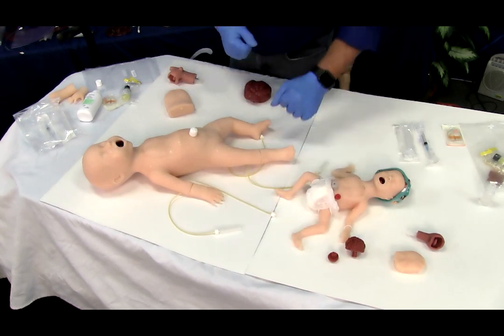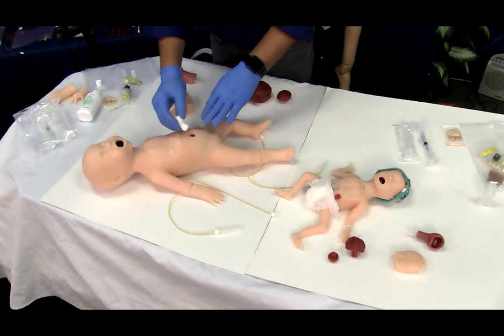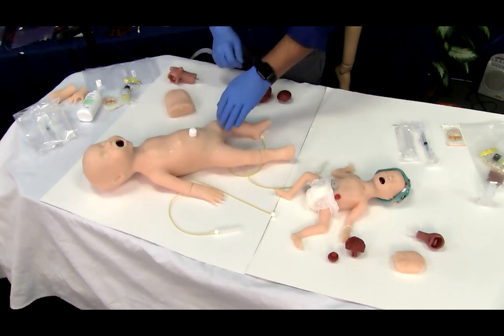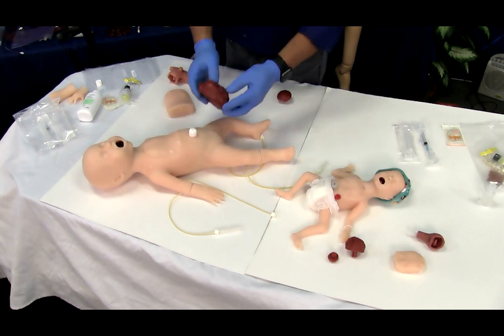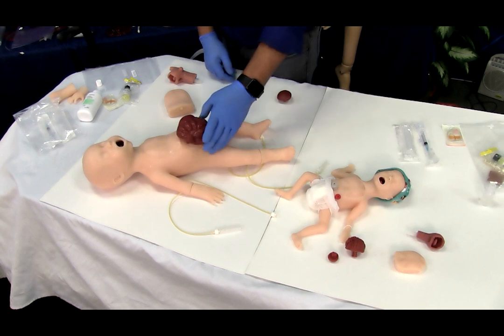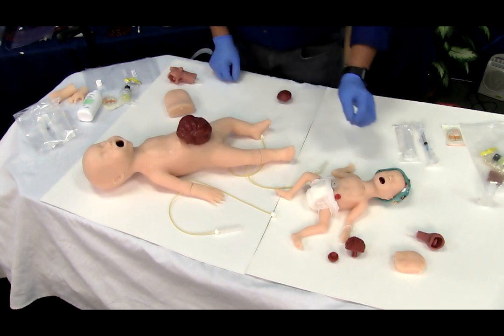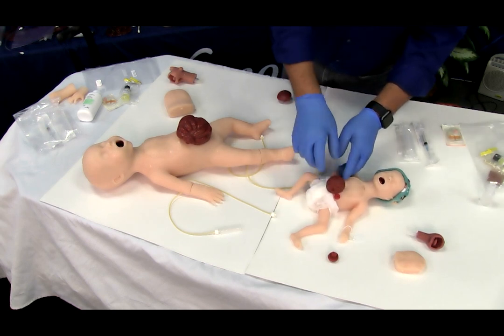The umbilical stump functions like a stopper, plugging into a small reservoir within the abdomen. The umbilical seal on the full-term infant can be inserted over the patent umbilicus. In a micropreemie, you will easily remove the umbilical cord and insert the umbilical seal.